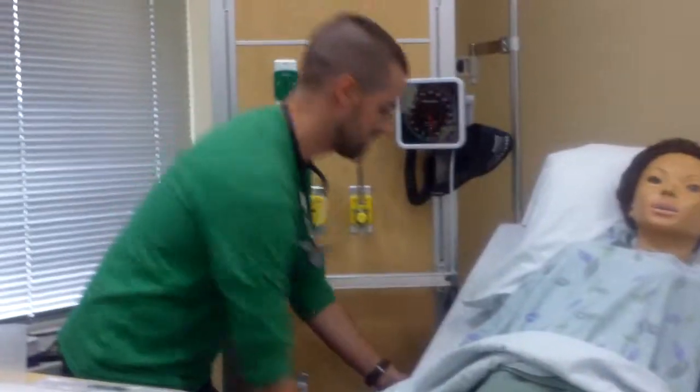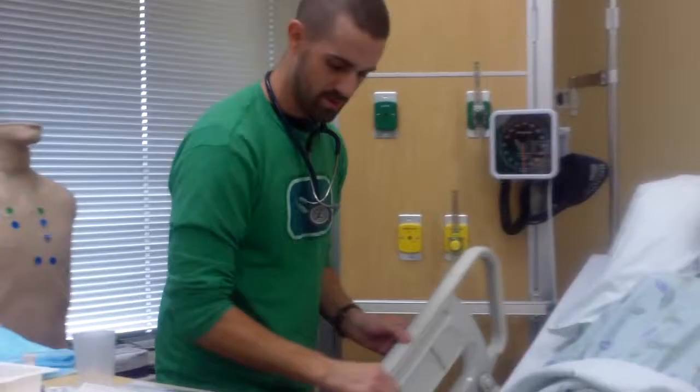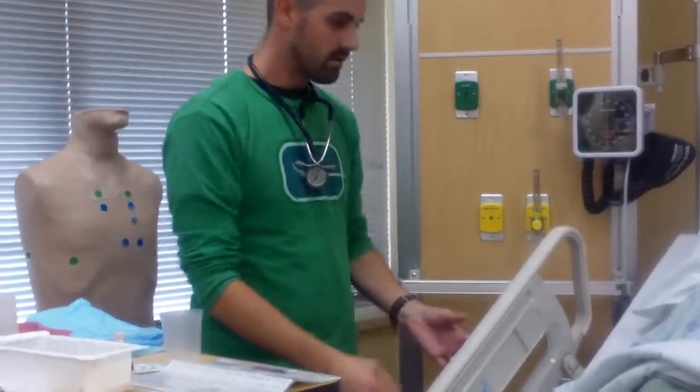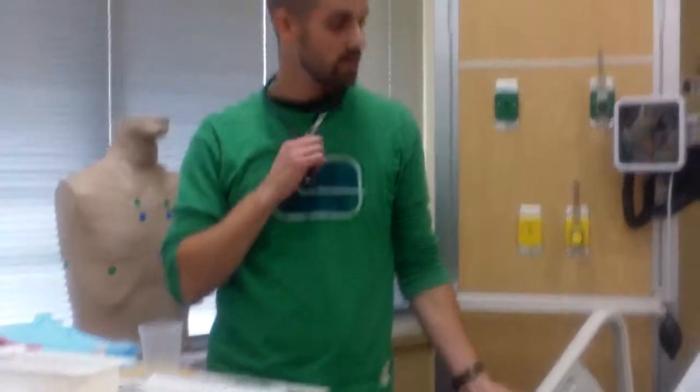Do the curtain again. There we go. The bed in the lowest possible position, clean up my stuff, and document how well the patient took the procedure, and make sure I did everything, and clean my stethoscope again because you can never clean your stethoscope too much, and that's my video.